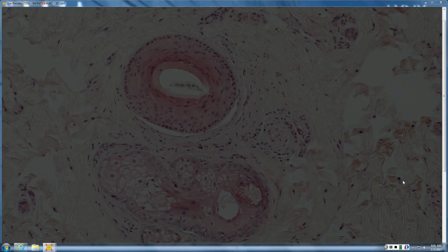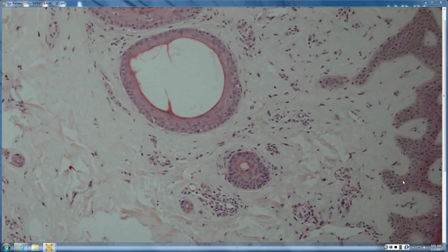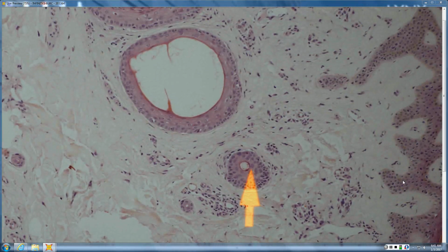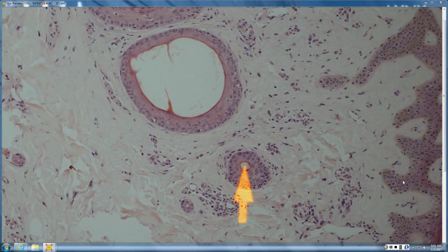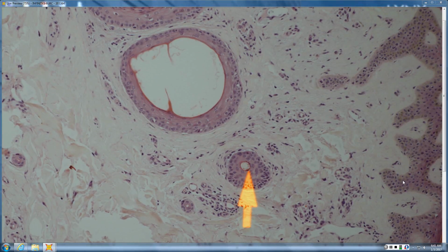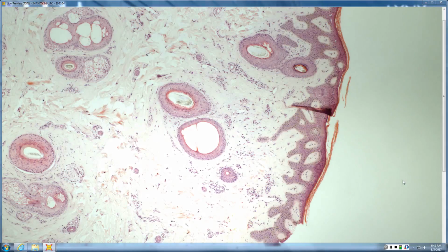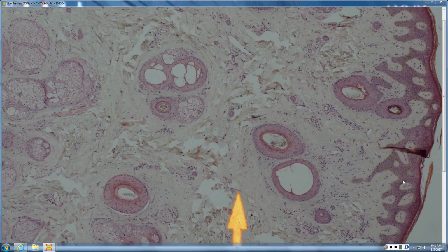And again with the vellus hairs, the hair shaft diameter gets really, really small, even smaller than the inner root sheath width, like this here, for example. So it's even smaller than that. So that is pattern alopecia, and sometimes it's subtle, sometimes it's very pronounced.